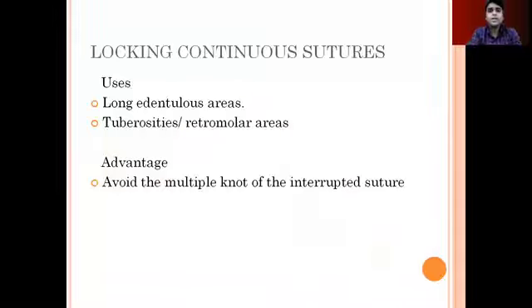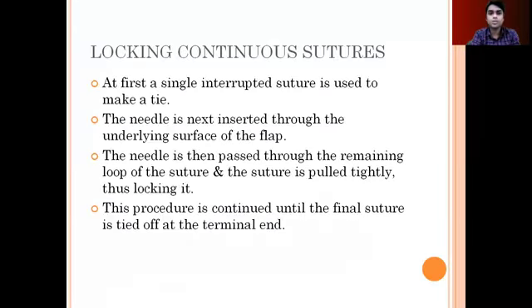Now the locking continuous sutures. Its uses include long edentulous areas, tuberosities, and retromolar areas. The advantages are that it avoids the multiple knots of the interrupted suture.